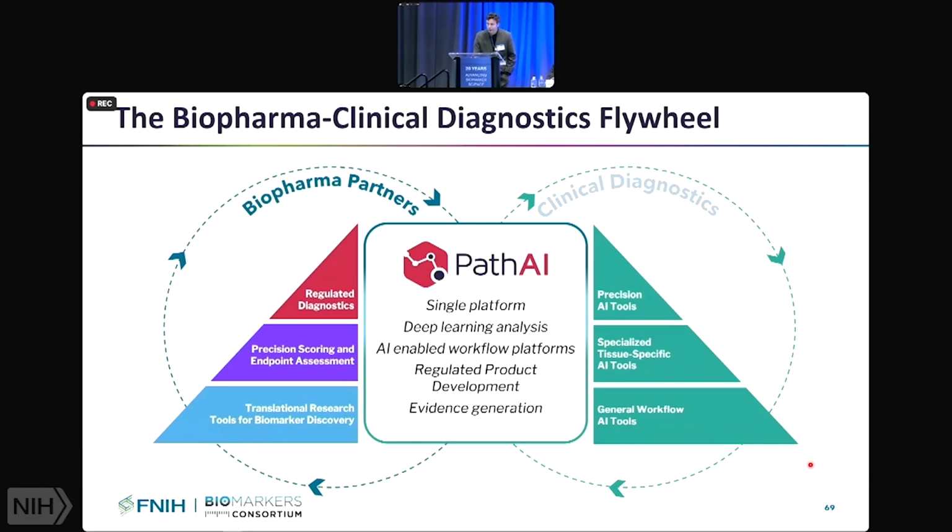And it's such a critical area because this is one of the few non-tissue destructive new technologies where you're actually preserving tissue. If you think about the standard of care in clinical diagnostics and historically entirely in drug development, these images weren't even captured. So the tissue is removed from the patient, it's processed into a block, a thin section is cut out, and the image may exist very, very transiently in the brain of the pathologist, and then it's gone and disappears and can't be used for knowledge and advancing either field.